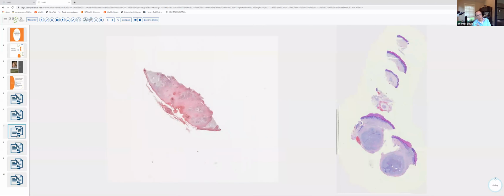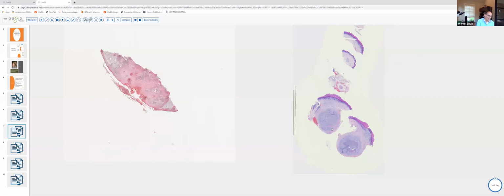Okay, those were the two longest, so I promise I'll be a little less wordy with the last couple. So our next differential, we're going to look at chromomycosis on the left versus Phaeohyphomycotic cyst on the right. How are they alike? Well, certainly both are caused by implantation of dematiaceous or pigmented fungal or mold elements into the skin. And they both produce suppurative and granulomatous inflammation within the skin. And as a result, clinically, they both tend to occur at sites prone to trauma, particularly the distal extremities.